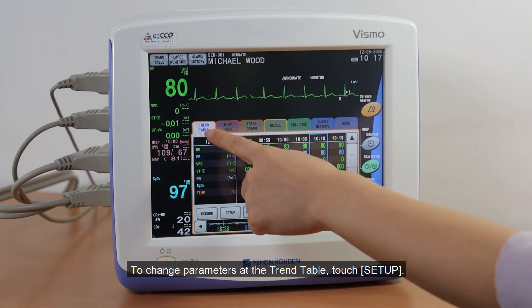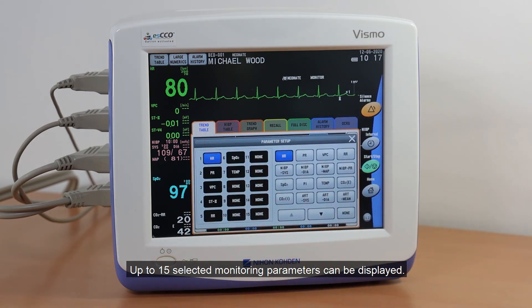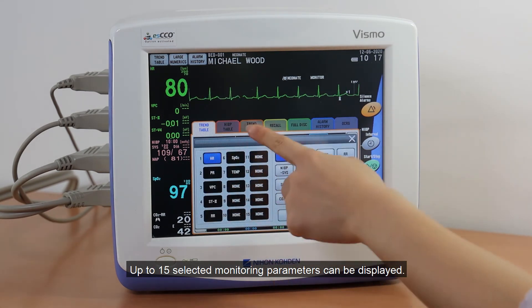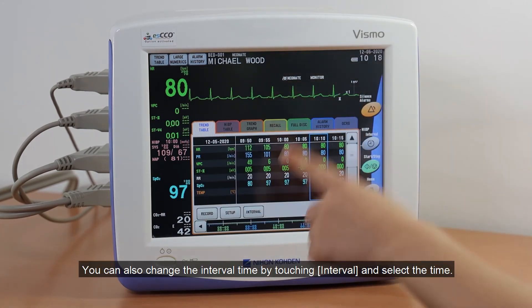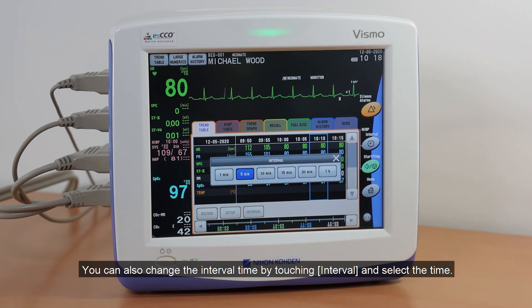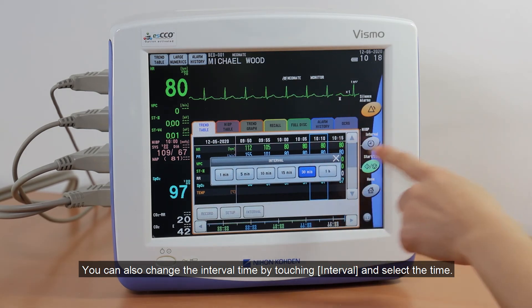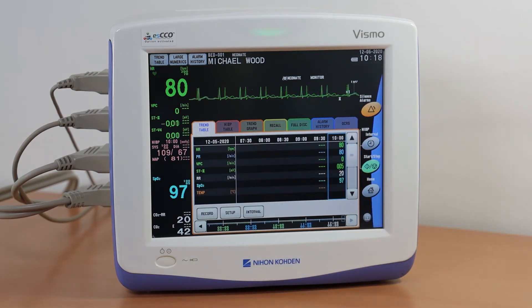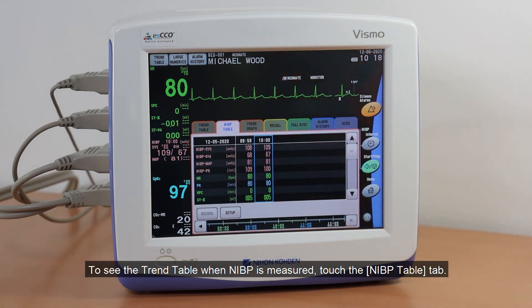To change parameters at the Trend Table, touch Setup. Up to 15 selected monitoring parameters can be displayed. You can also change the Interval time by touching Interval and selecting the time. To see the Trend Table when NIBP is measured, touch the NIBP Table tab.